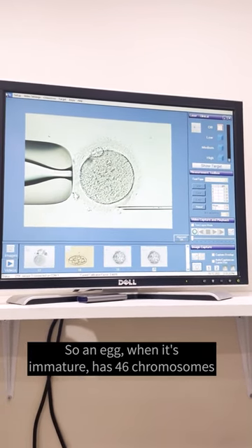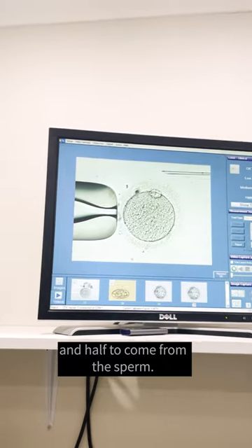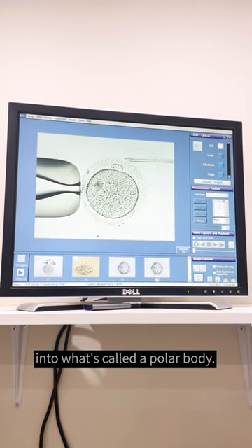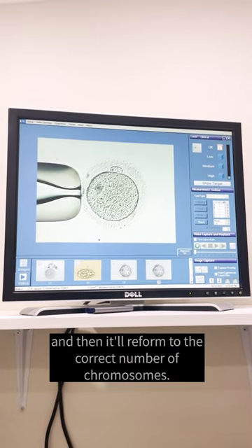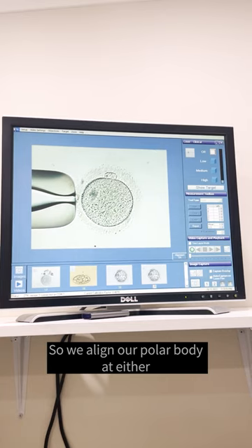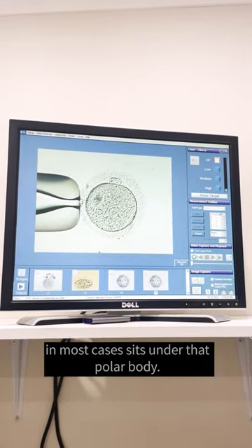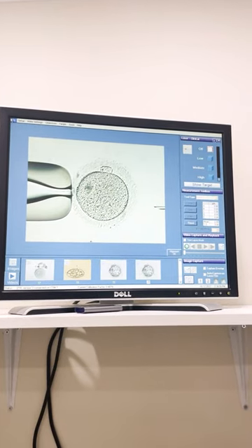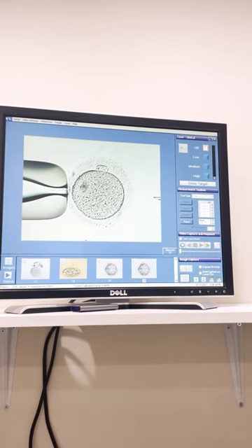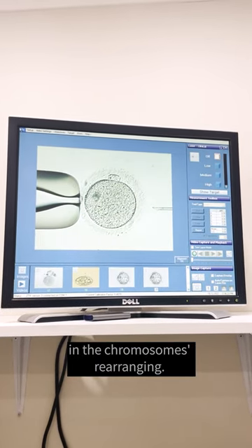Now we align the polar body of the egg. When an egg is immature it has 46 chromosomes, but we want half the chromosomes to come from the egg and half to come from the sperm. So when the egg becomes mature, it injects half of its chromosomes into what's called the polar body. We then inject our sperm and the correct number of chromosomes is reformed. We align the polar body at either 12 o'clock or 6 o'clock because the meiotic spindle, in most cases, sits under that polar body — so it's very important not to pierce that spindle with our needle, because that will cause aberrations when the chromosomes are rearranged.